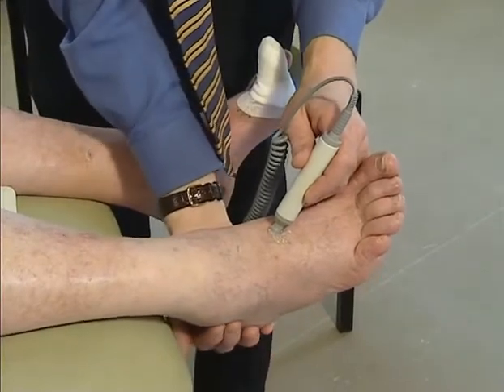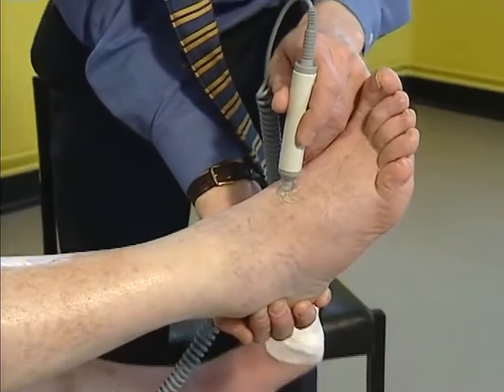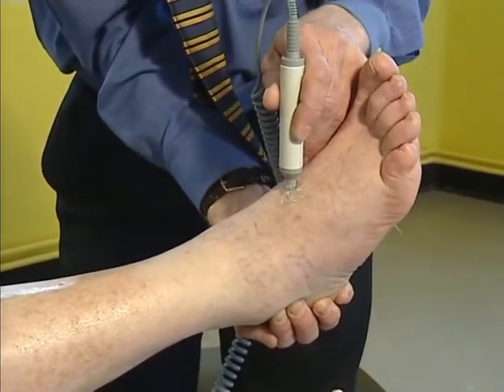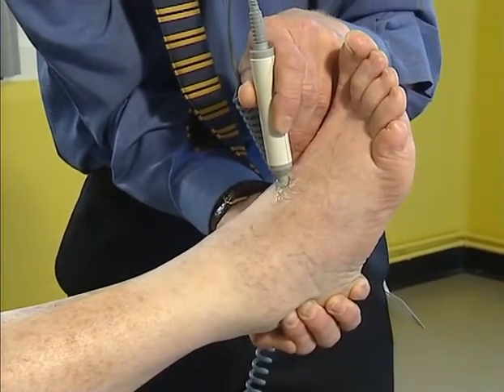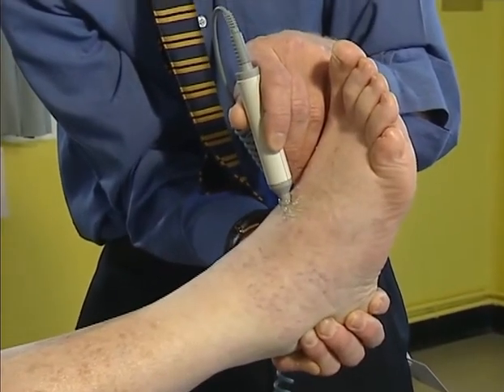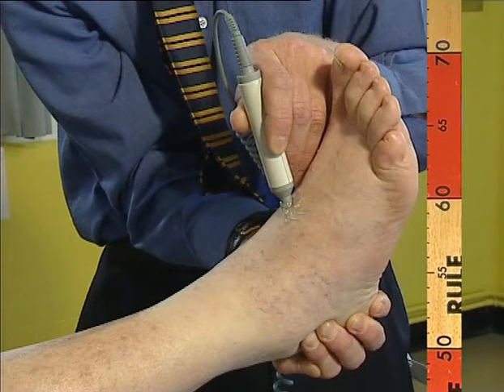The pole test is undertaken by holding the Doppler probe over the vessel whilst elevating the leg from the horizontal position and listening to the arterial signal at the same time. If the pressure drops in the artery as we elevate the limb, the arterial signal will change or fade, indicating a compromised arterial circulation. If a graduated pole is available, the height at which the signal disappears can be used to estimate the ankle systolic pressure.